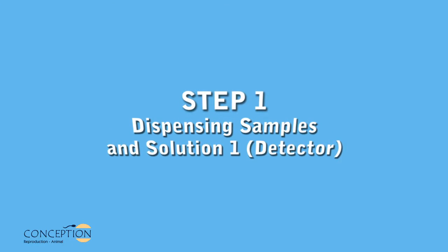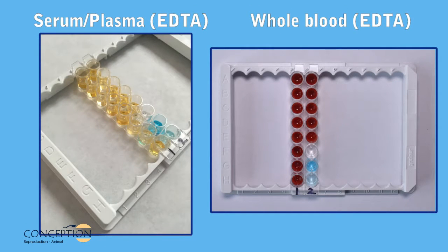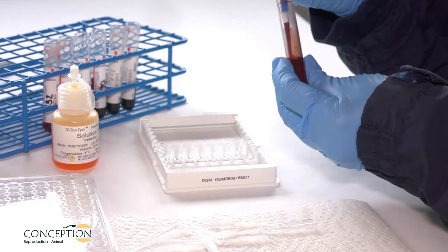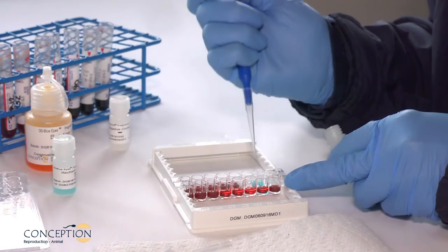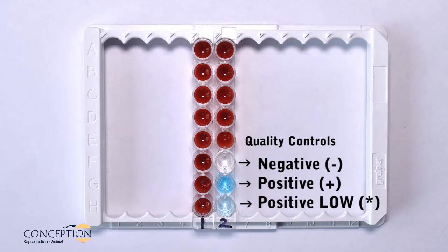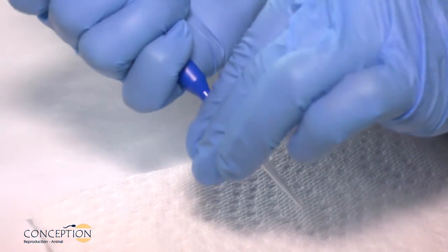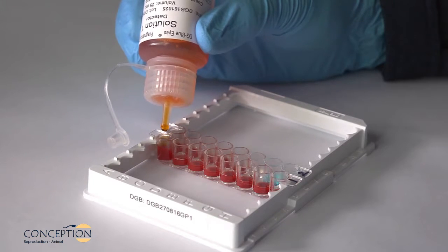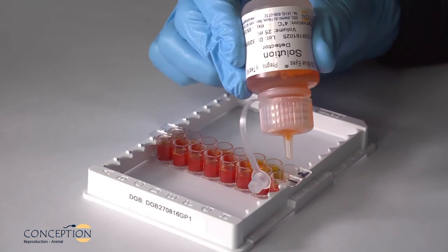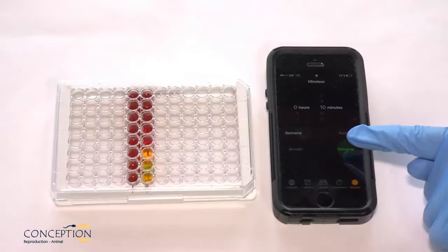Step 1: Dispensing samples and Solution 1. Serum, plasma EDTA, or whole blood EDTA can be used for analysis. Referring to your framework, use the mini pipette and disposable tips and add 100 µL of each sample and quality control — negative, positive, and positive low — into the corresponding individual wells. Change tip after each sample and each quality control. Gently shake Solution 1, detector, and dispense three drops into each well. Gently shake the plate to mix, cover the plate, and incubate 10 minutes.